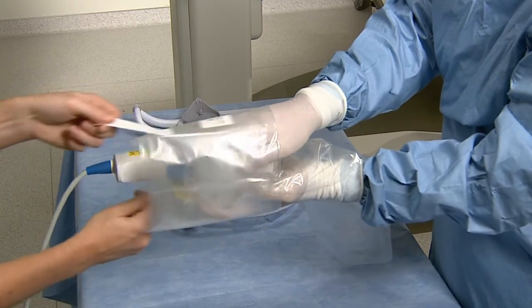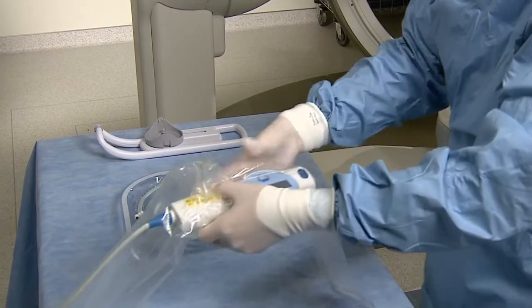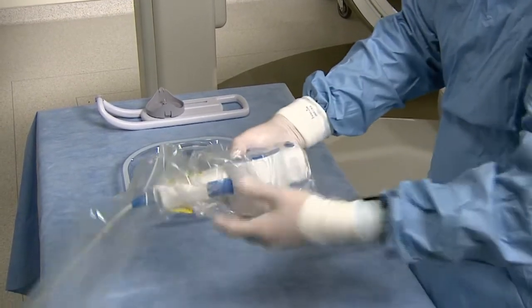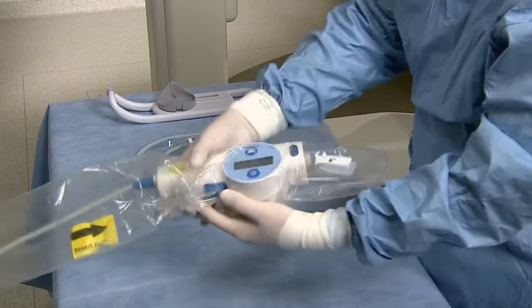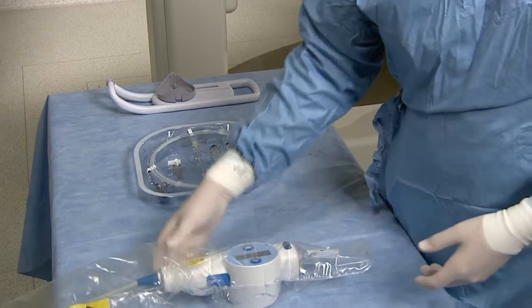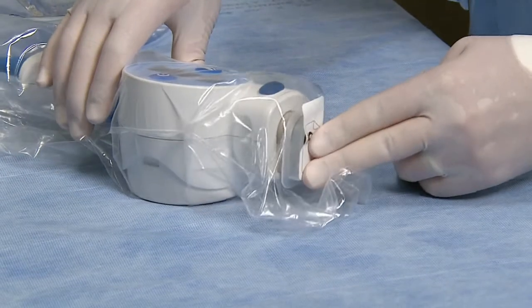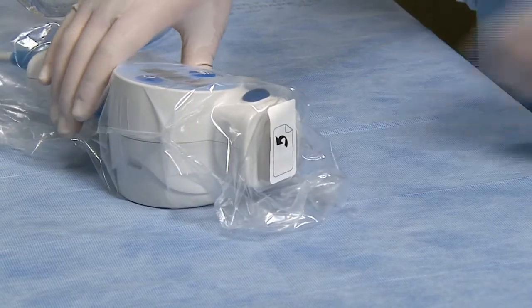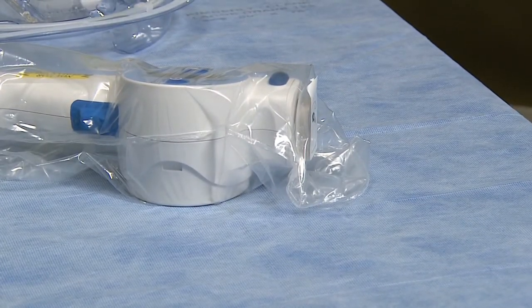Working together, the operators unfold the bag, extending it to its full length. The sterile operator then attaches the faceplate to the motor drive unit, ensuring that no bag material is caught between the faceplate and the motor drive.